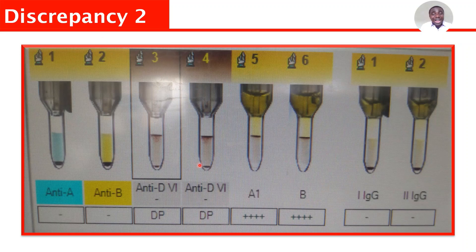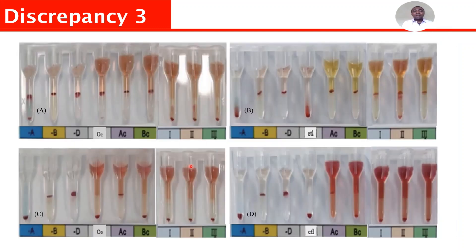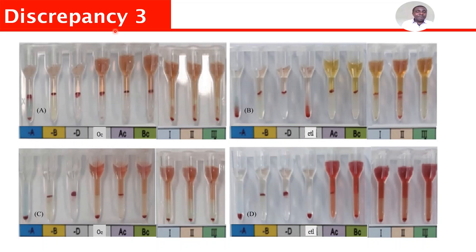The key word here is discrepancy. These are factors that can lead to discrepancy in blood group and antibody screening. Here is an example of how cold agglutinins can lead to discrepancy — you can see there is reaction everywhere. You cannot get a clean result until that cold antibody is removed. This is a typical example of cold agglutinins affecting blood group and antibody screening.